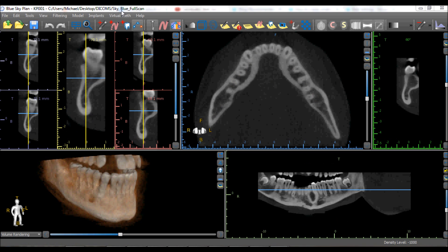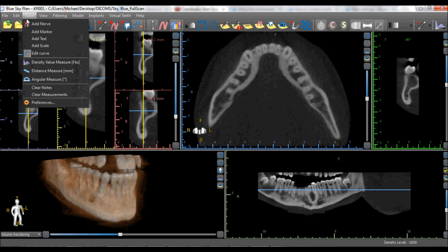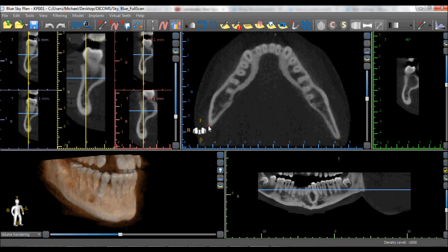In addition, the user has the ability to draw a new panoramic curve by going to Tools > Edit Curve. The left mouse button can then be used to place nodes around the arch of the patient, and the software connects those nodes to create the panoramic curve.